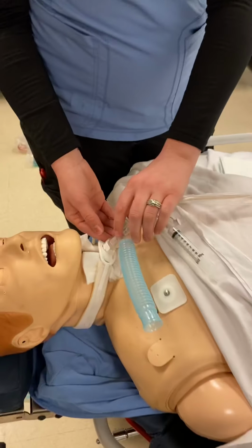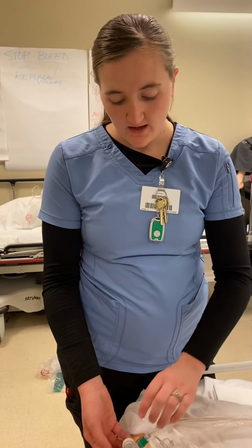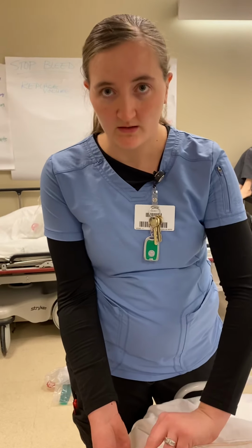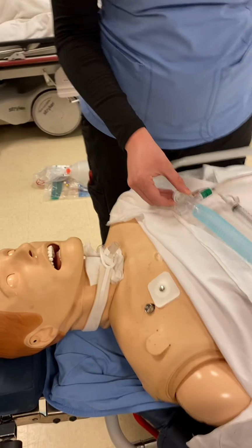Okay, so I always suction first, try to get any junk out. I wouldn't do it more than 2 or 3 times because then you're going to be over suctioning that patient. What happens when you over suction? You just cause a lot of respiratory distress, coughing, and sometimes if you're hitting the carina in the lung, you can cause a little bit of bleeding as well. So you just want to be mindful of that.